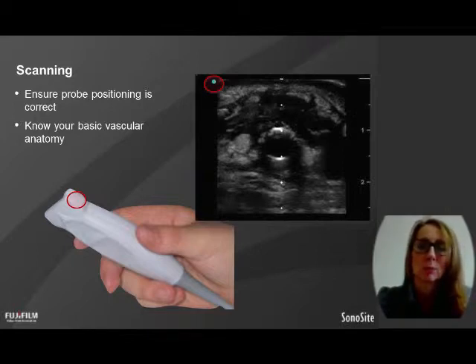This is particularly important when you're doing cannulation, because if you're inserting the needle and it's slightly crooked and you want to straighten it, and you've got it the wrong way round, you'll be trying to move your needle to the right and it'll actually be going to the left on you.